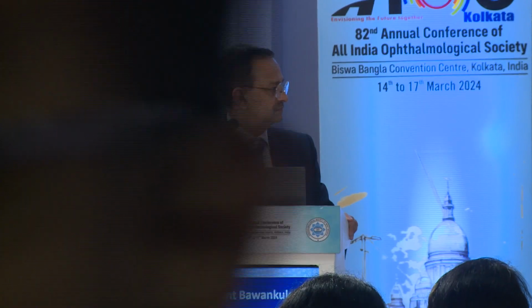So when you find a lesion on the angiography, to go to the same place on the OCTA, a point-to-point, pixel-to-pixel correlation is difficult. You can approximately say it, but you may not accurately say it, because the machines are different. If somebody has a Silverstone, they can do it exactly because it's the same machine. But we are using separate systems. The Heidelberg is capturing the FFA and ICG and the Plex Elite is capturing the OCT. So you have to do it in your mind or by approximation. I'm sure you can make an algorithm for that, but otherwise you have to do it.